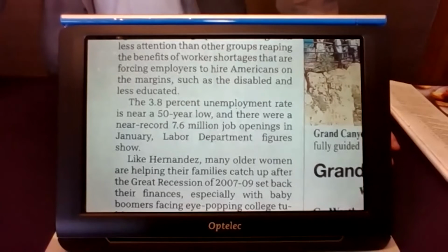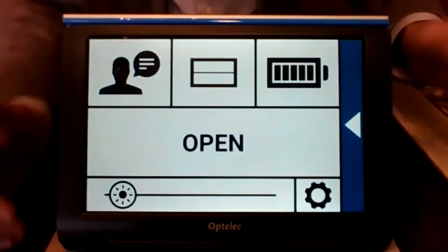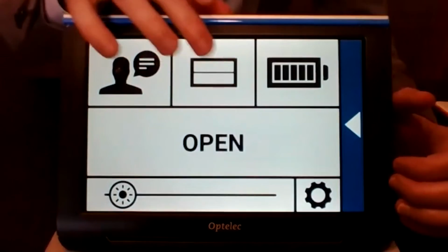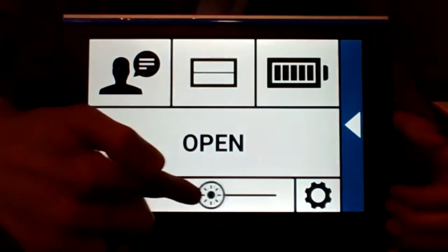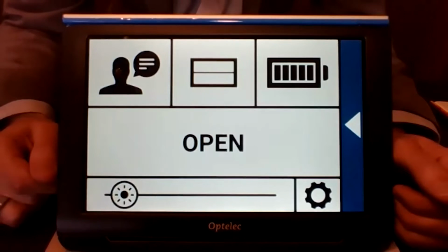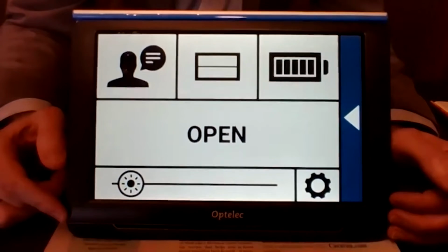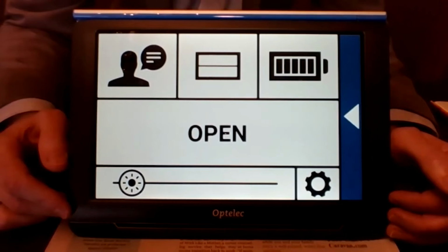Yeah. So just pop into the menu system, because as a reading tool, you're demonstrating the reading mode here, and there are some great reading features in here. So, screen brightness, nice and easy on the front, down that sliding scale. If you want to reduce the glare, having that control intuitively located is very helpful, because if you haven't got the screen brightness set correctly, it can make accessing anything kind of difficult.